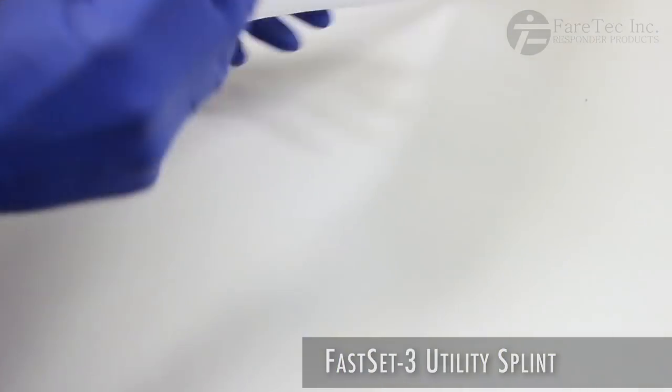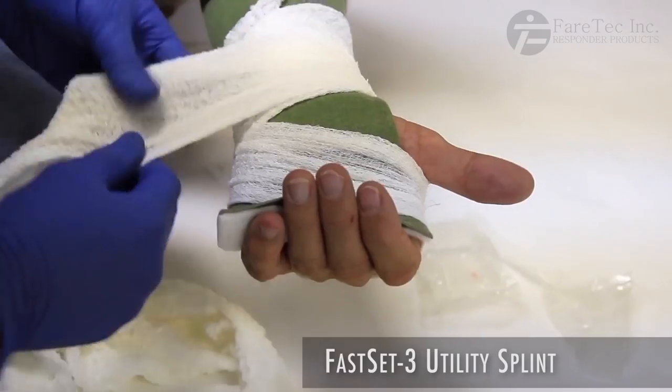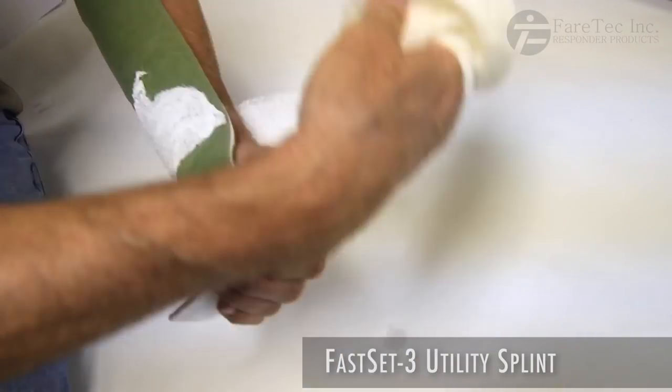The FS3 requires the responder to simply wet the splint and wrap it onto the patient. The splint will harden in 3-5 minutes, allowing for a custom fit.